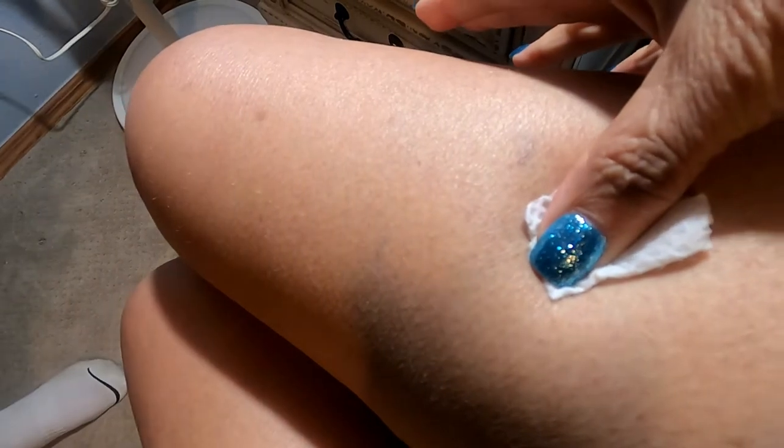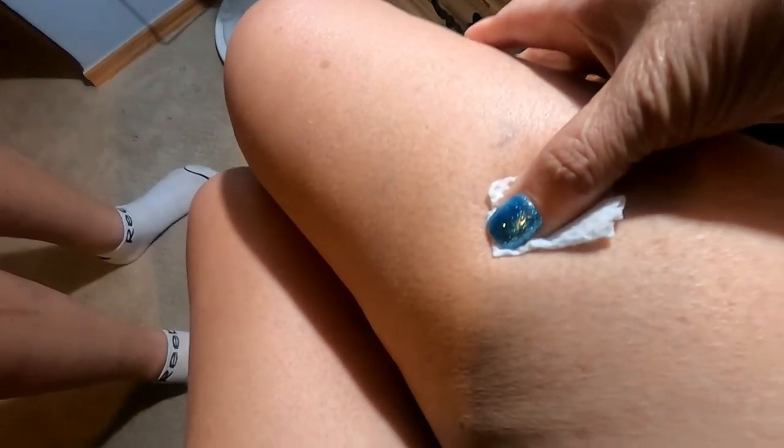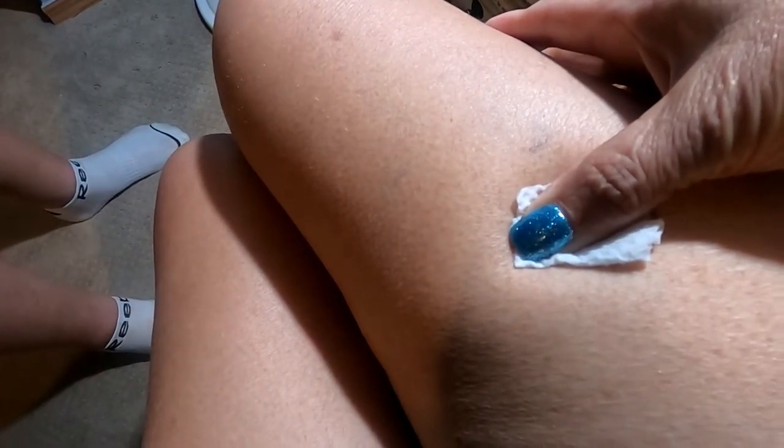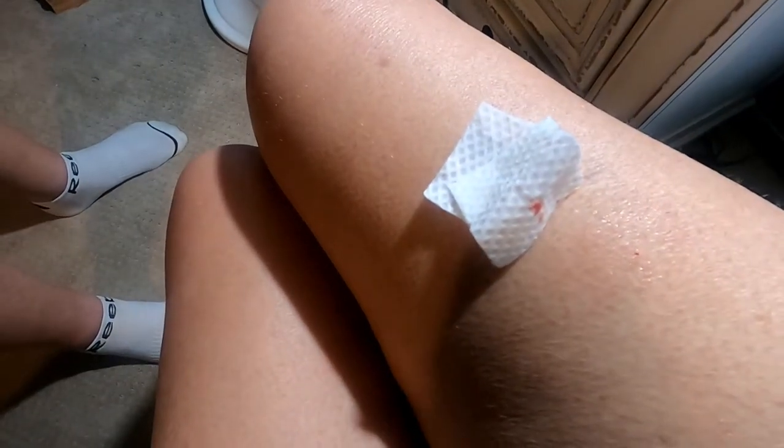If you see a little dot of blood, that's usually a good sign it went in — and there it is. I'll just use this wipe for that. I've got my little band-aid — no, I'm good. There we go, I did it! I was a little nervous. That one stung a little bit more, maybe just because you're more nervous when you don't have someone right there guiding you. The remaining doses are all in the fridge.